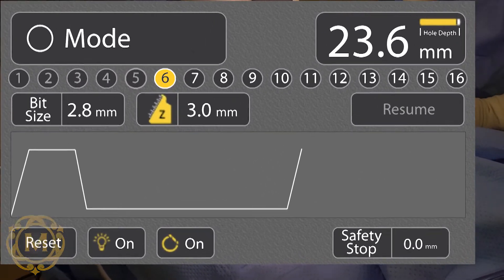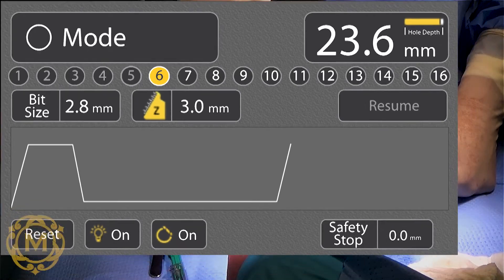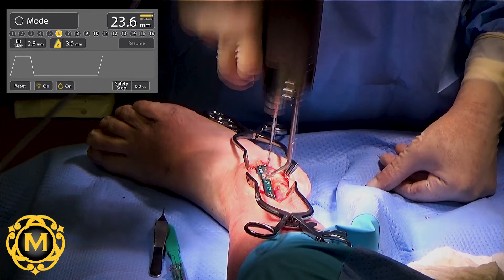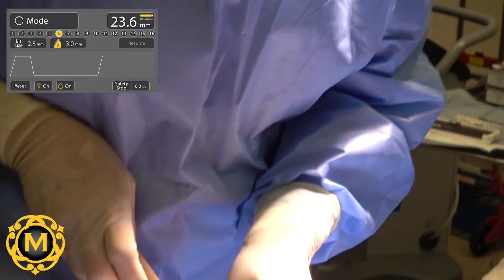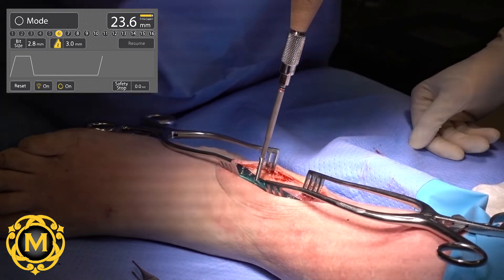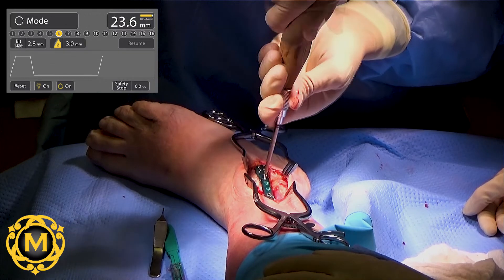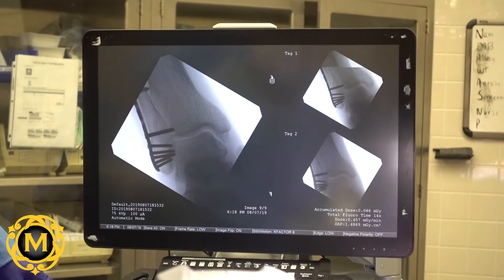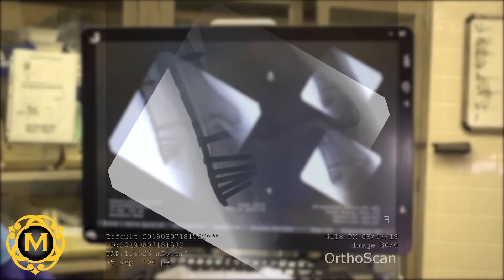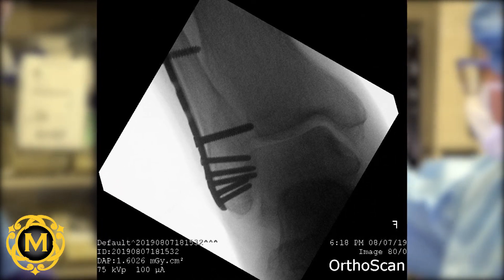The IntelliSense controller displayed a real-time drill depth measurement of 23.6 mm. With this IntelliSense measurement, the surgeon was able to forego a manual depth measurement step and, without delay, selected a 3.5 mm by 22 mm screw for the sixth and final hole of the Acumed lateral fibula plate. Using a mini C-arm, final x-rays were taken and evaluated. The surgeon was pleased with the hardware selection and placement for this application, and the procedure was concluded.